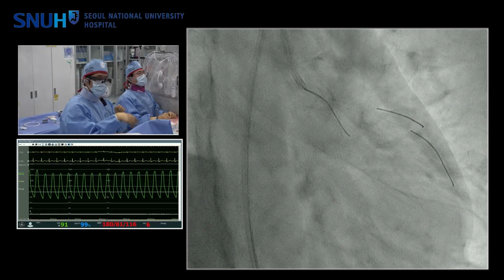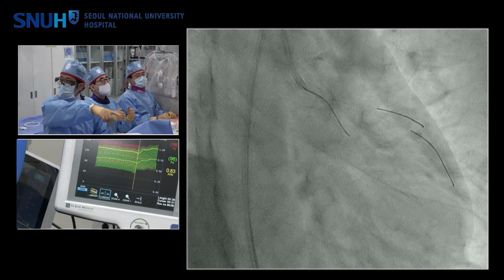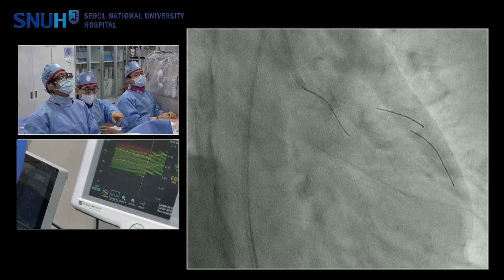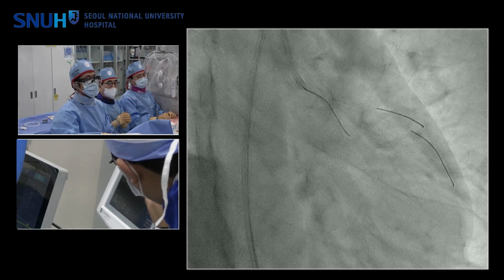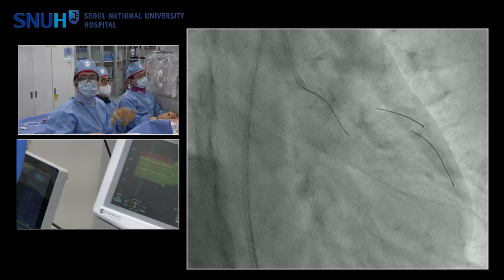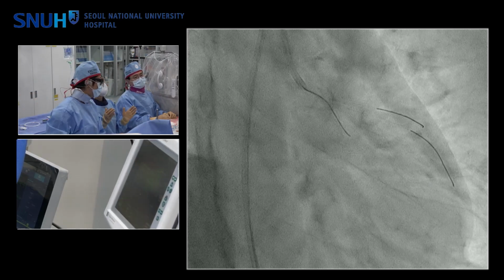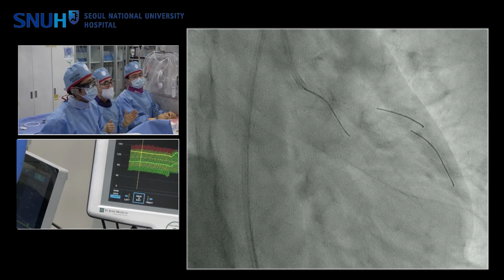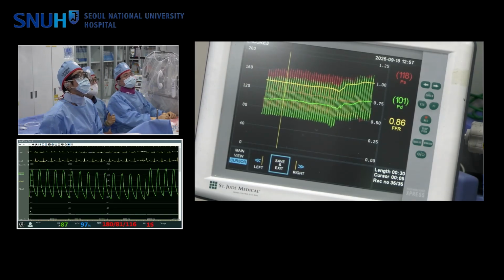Yeah. It is impossible to transmit the FFR screen. 카메라 좀 보여주세요. I just convey. So it starts at 83 and reaches 100. So this FFR measurement was correct. The MUFR was 67, 0.68. In this particular case, mu FFR post stenting overestimated the severity significantly.